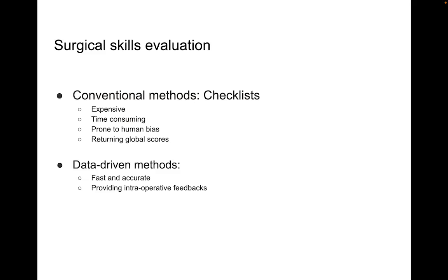There are two main types of evaluation methods: conventional methods, which are based on checklists and are expensive, time-consuming, prone to human bias, and they will return global scores for a given task. And data-driven methods, which are fast and accurate, and they will provide intraoperative feedback. Due to the availability of surgical procedure data, we can use artificial intelligence for automating the surgical skills assessment. In this research, we will focus on the second type of evaluation.